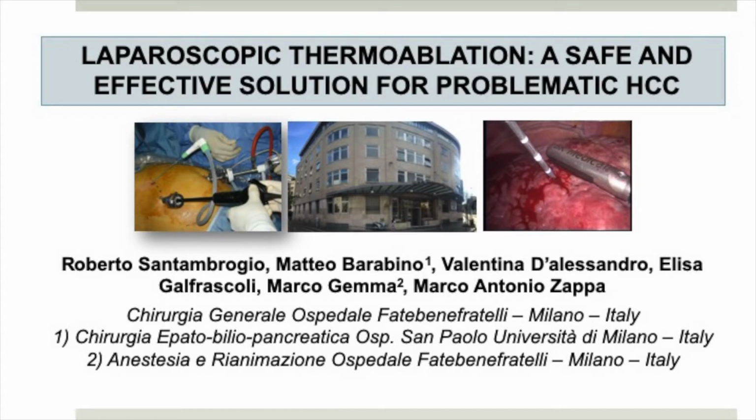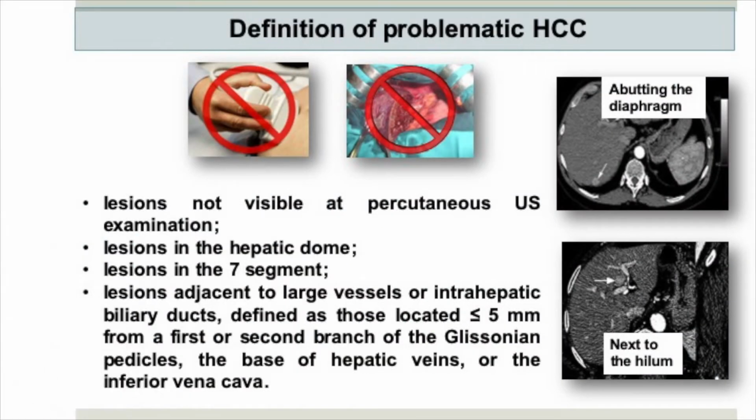The video shows our experience with laparoscopic thermoablation for patients with problematic hepatocellular carcinoma. But what is a problematic hepatocellular carcinoma for a percutaneous approach?